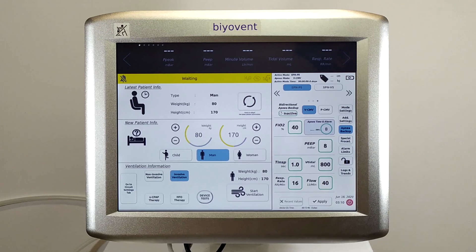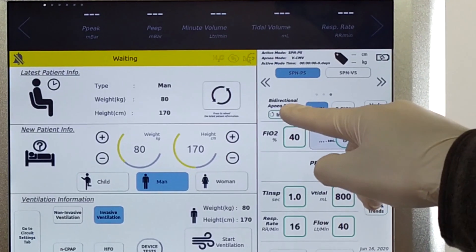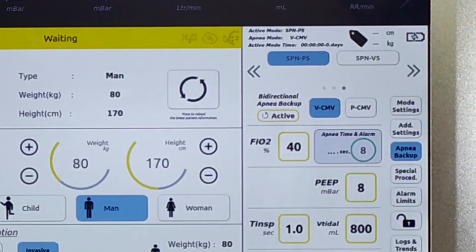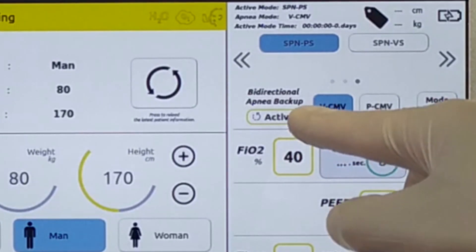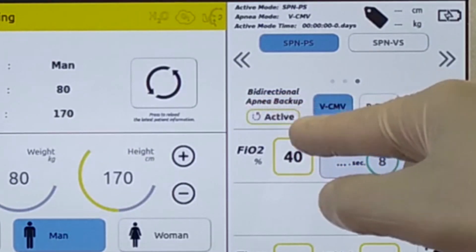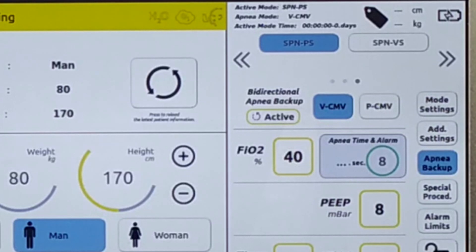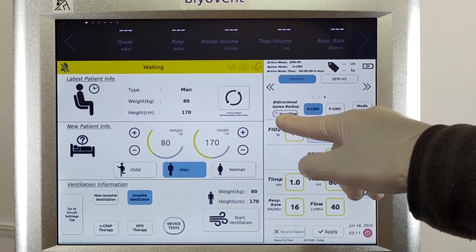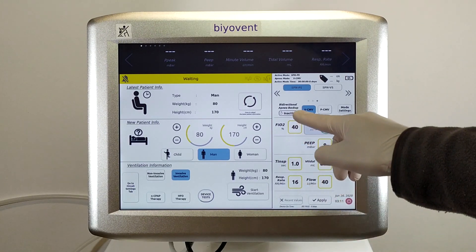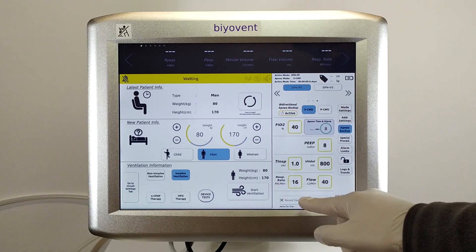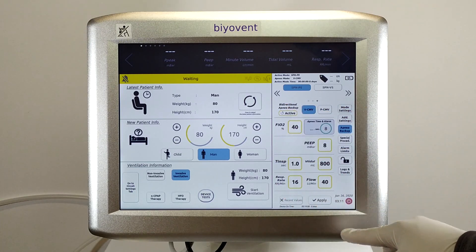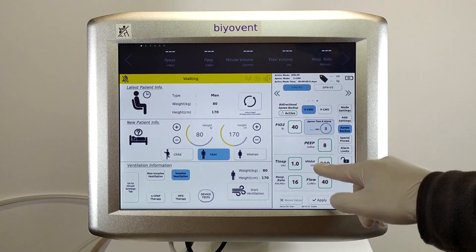You can also activate the bidirectional option to make the apnea mode bidirectional. The bidirectional option is used to switch the ventilator from apnea mode back to normal spontaneous mode when the patient triggers again. When this mode is active, it should be lit green. Press this option while in active mode to deactivate — it will turn yellow. After pressing the apply button, you can activate this mode.